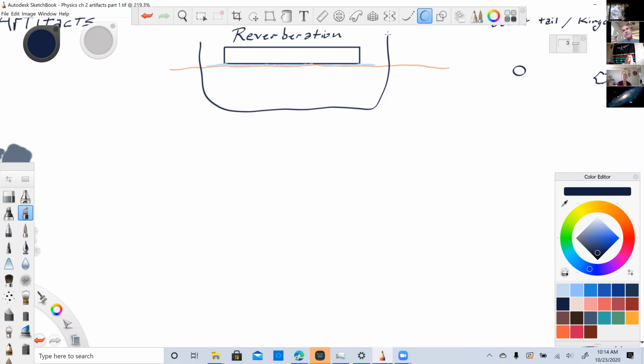What you saw, if you had too much depth on your screen, or if you got the transducer too close to the bottom, is sound going in, reflecting back, which is good. By the way, a very, very bright reflector, basically pretty much 100% reflection, almost negligible amount going through. So it was a very bright line representing the bottom of the Tupperware. And if you got a little closer, or if you changed your depth so that you saw more, or waited longer for more echoes, we would also see another reflection, and then another reflection. And this is sound literally bouncing back and forth between the face of the transducer and the bottom of the Tupperware.